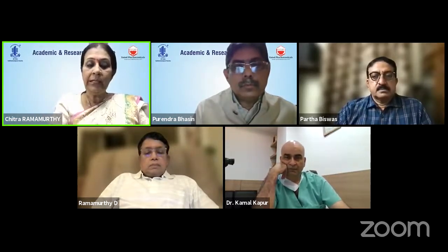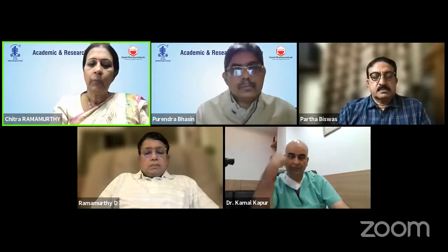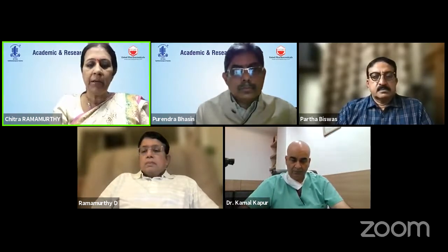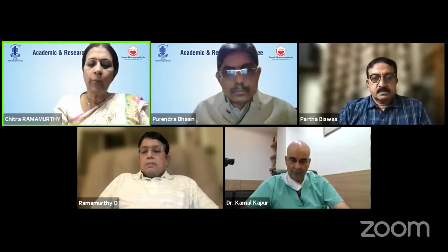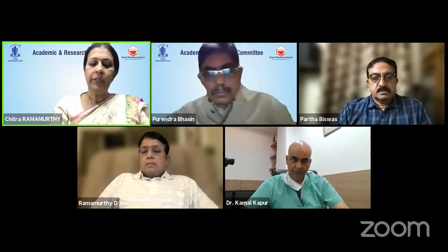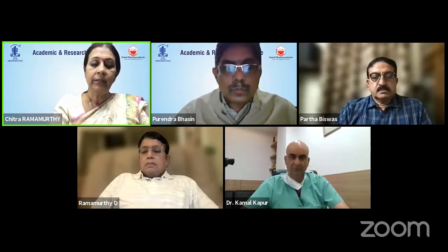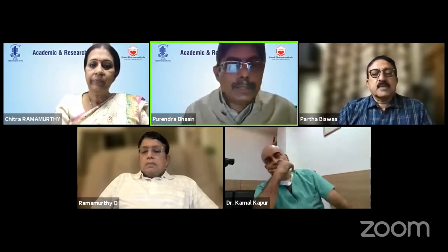Taking you to a different setting, a 35-year-old pre-presbyopic with a 3 diopter power with good AC depth. I would want Dr. Purendra Bhasin and Partha to comment on this. A 35-year-old with a +3 diopter power with a good AC depth. Would you talk of a phakic IOL, or would you consider a clear lens extraction? +3 diopters, 35 years old.